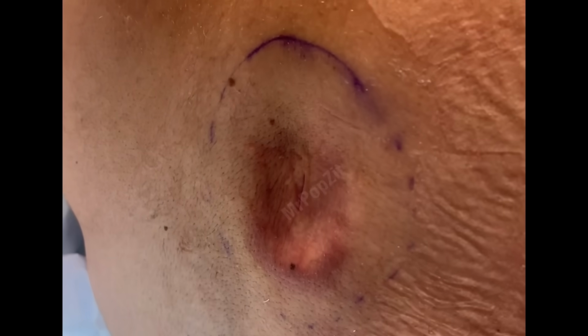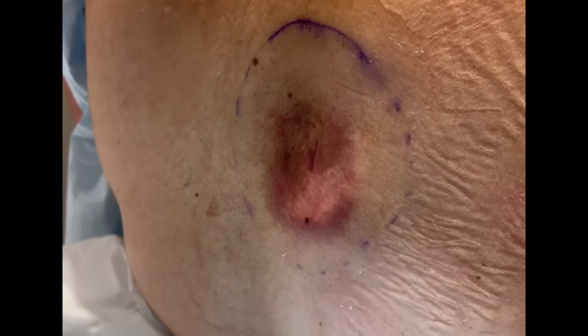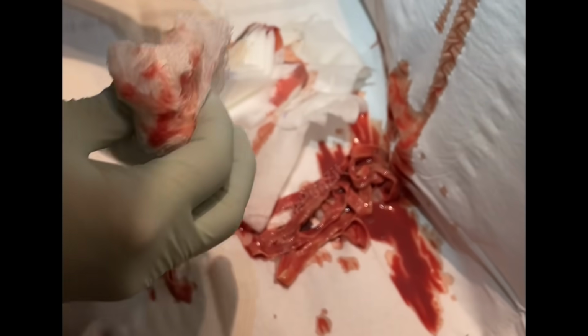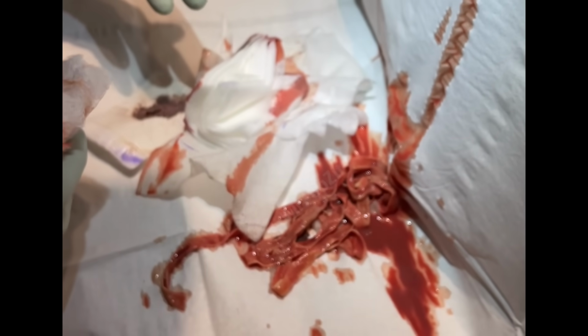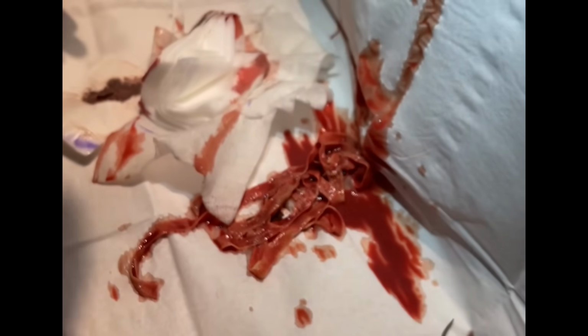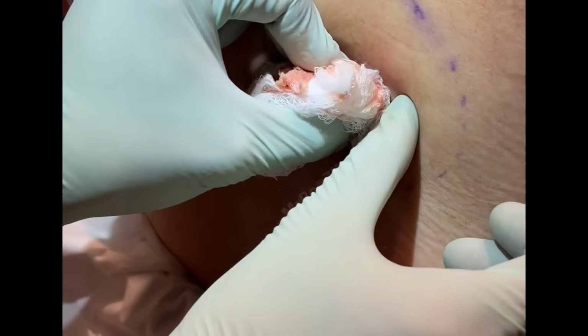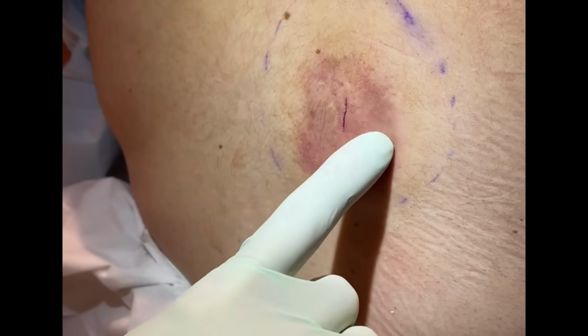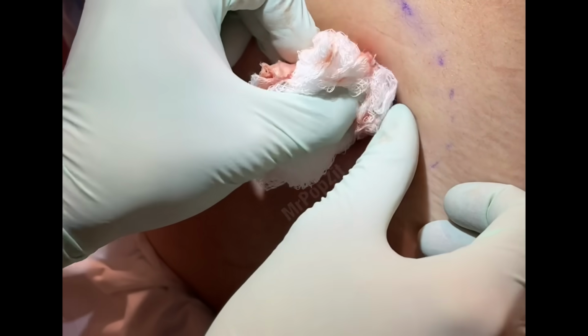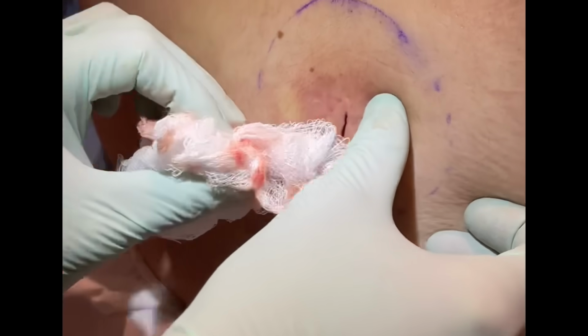Perfect. And you can see all the discharge we got down here, quite a bit. If we come down, you can see there. So she's still making fluid in that first 48 hours, and given the amount that she had to begin with, totally expected. And now we're going to put a pressure bandage on here, and we'll see her again in just 1 week. Okay, good. Her redness has gone way down. That's just kind of turned into brown already. Nice and soft. I don't feel anything in there. So that's all the fluid we can get out today.